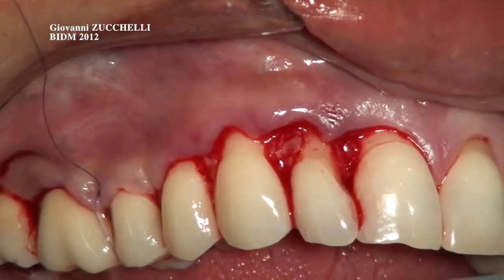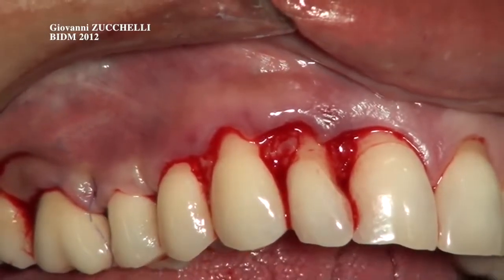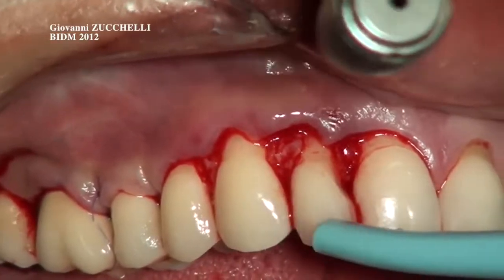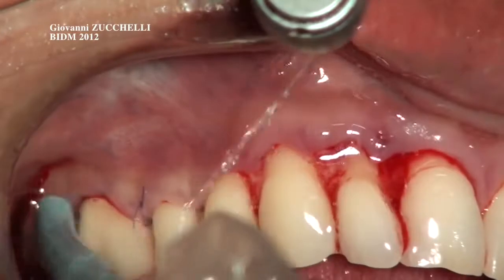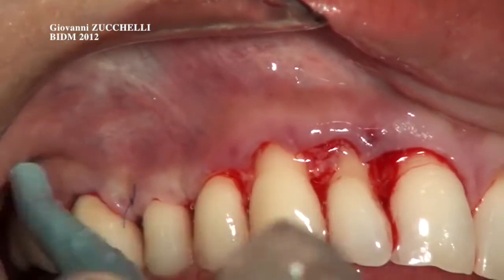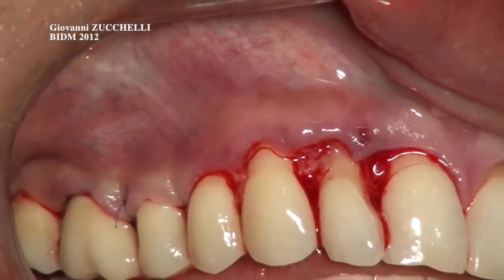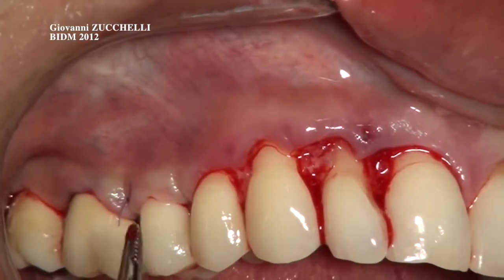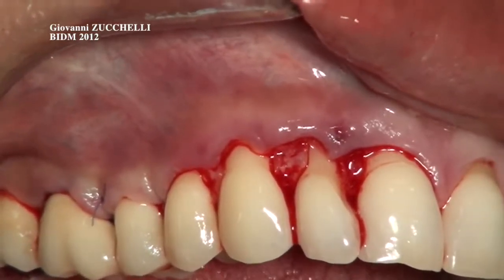Now I remove the remaining sutures. So please suction here. You don't have to see any blood escaping from the flap, and the flap must be completely fitting above the convexity of the crown, both the premolar and the molar.